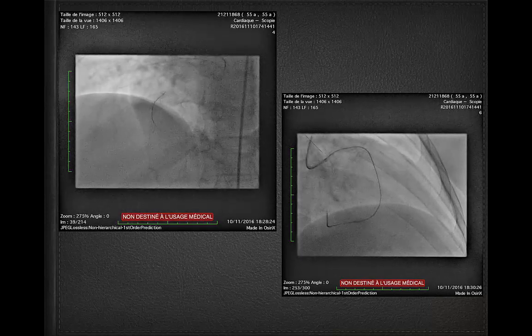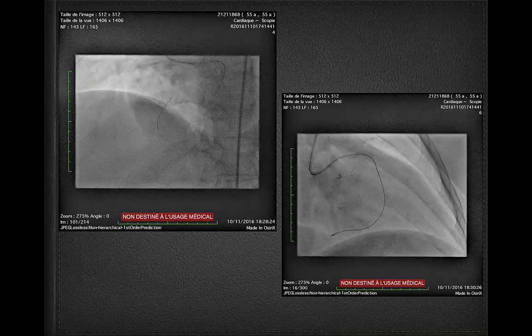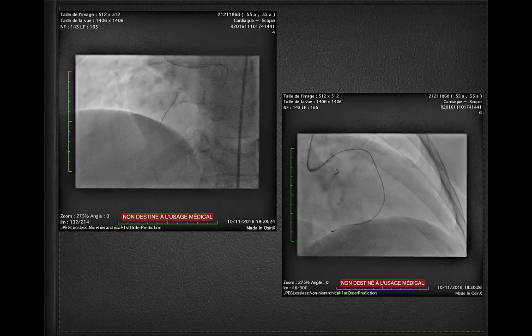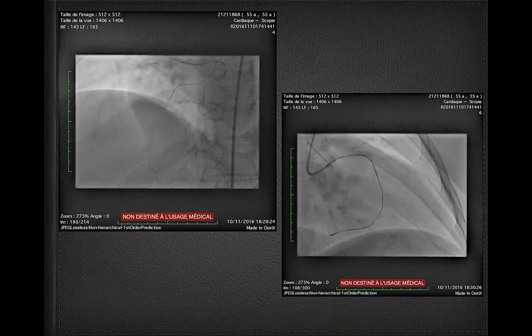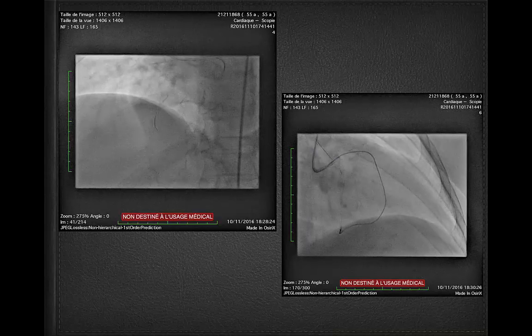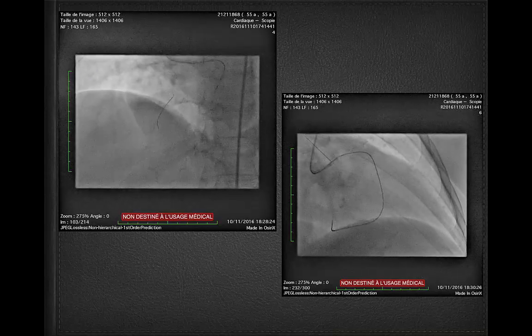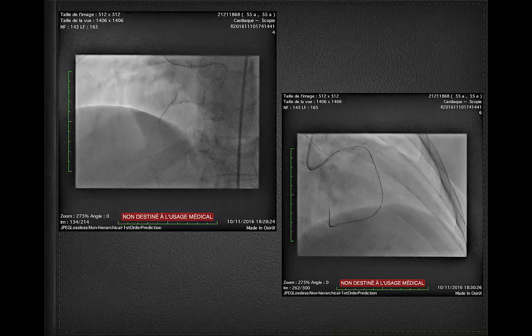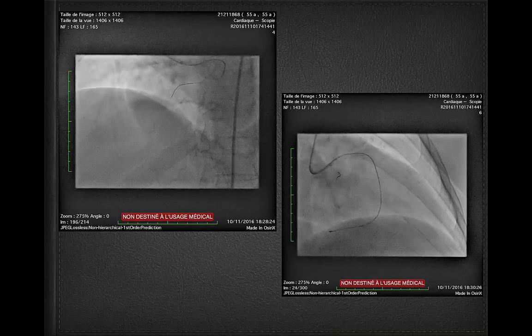So my Corsair was still in the beginning of the septal, and I was able to, with the Cyan black, go true lumen to true lumen and then outside. The length of the occlusion was very, very short. It was only at the beginning of the stent, at the part where we were in trouble.